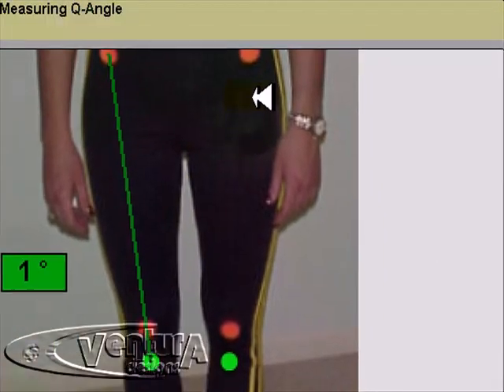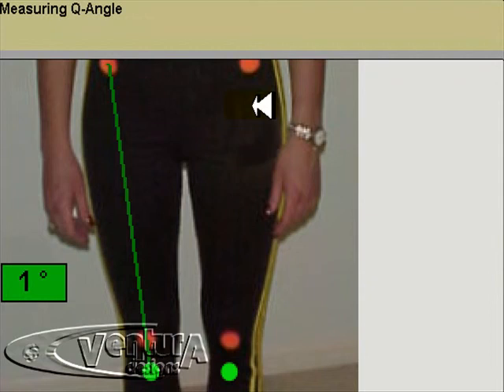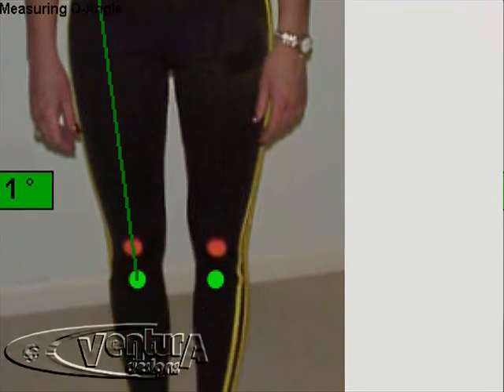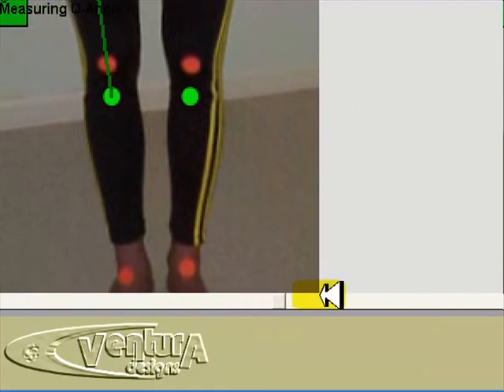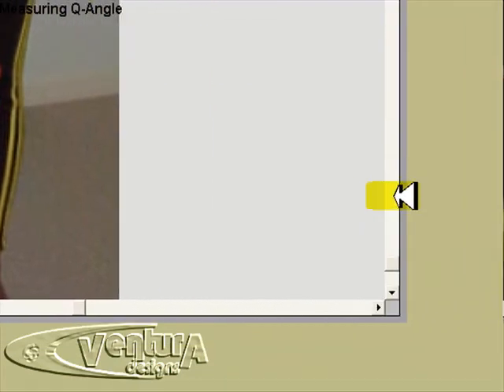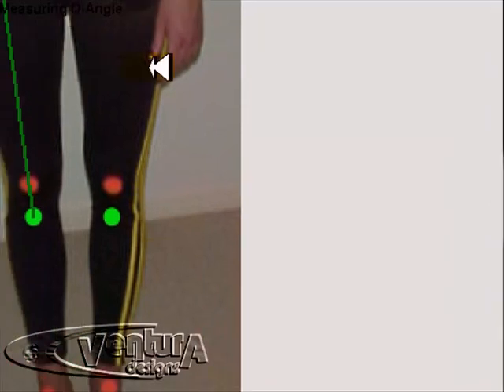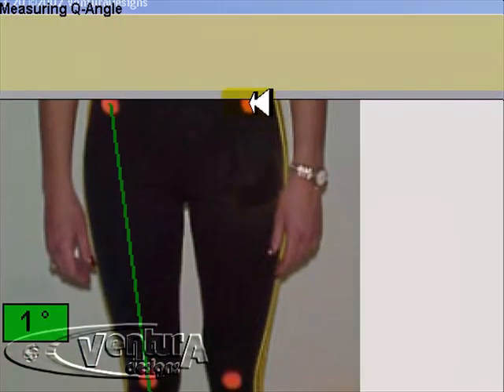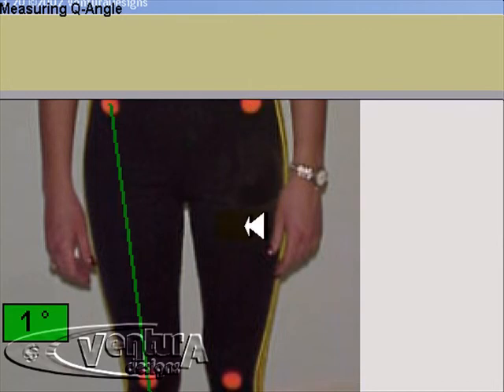If your picture is too large to see all of the dots at once, you can use the scroll bars that appear at the bottom and at the side to move the image. Even if you need to make a click, you can still go over to a scroll bar and move the image, and it will not count as an additional click.